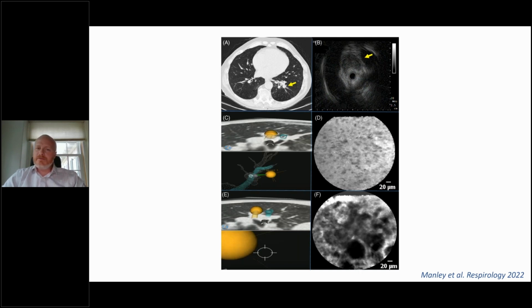And so I think there's a difference between being in the geometric or 3D center of an area of interest and then actually being able to probe that tissue and evaluating where the lesion is specifically, or where the tumor cells may be lying.